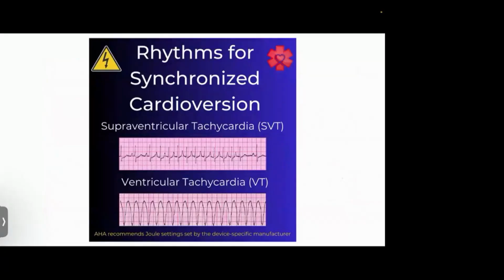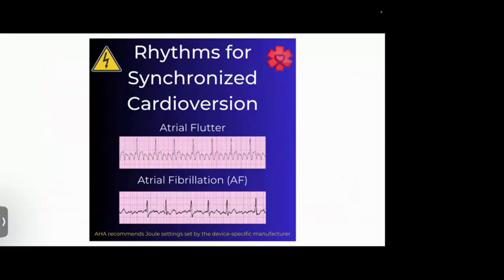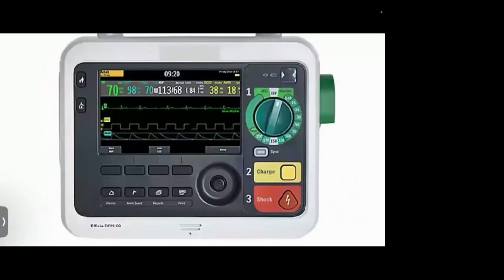Now, rhythms for synchronized cardioversion: supraventricular tachycardia, and ventricular tachycardia if they are not pulseless, then you have to go for this synchronized cardioversion, apart from the atrial flutter and the atrial fibrillation. So these are the particular rhythms that you should be considering.